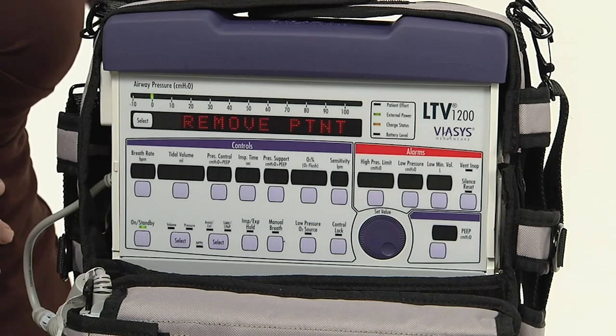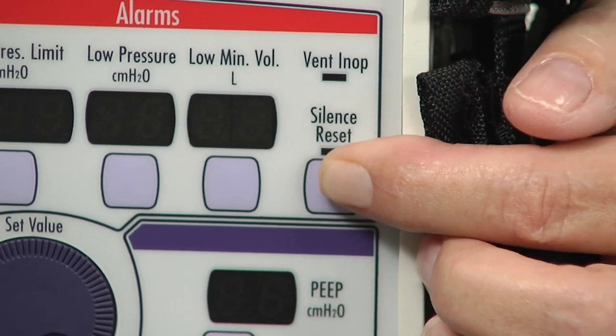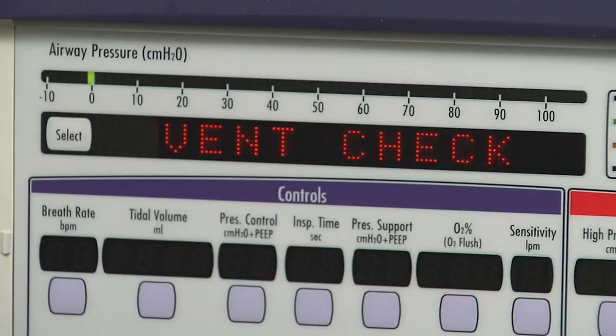An audible alarm will sound while 'Remove Patient' is displayed. Clear the alarm by pressing the silence/reset button. Once the audible alarm silences and the display changes to 'Vent Check,' the display has now changed to vent check.